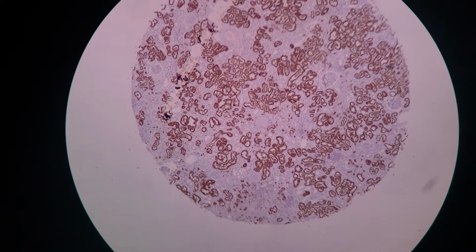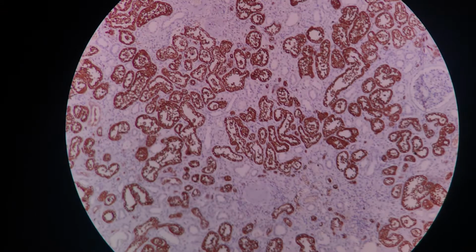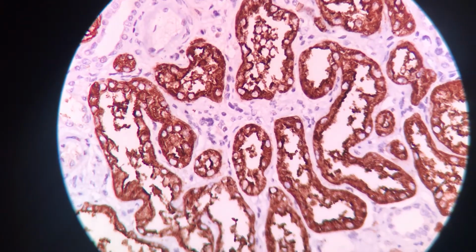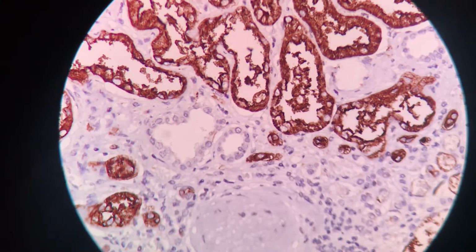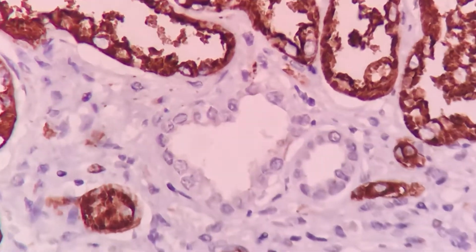Now this is the normal kidney, and you can see that the tubules are nicely stained. The tubular lining epithelium is very nicely stained. And if you see, these are the proximal renal tubules, which have got very intense cytoplasmic staining, but at the same time the distal tubules are not getting stained at all.